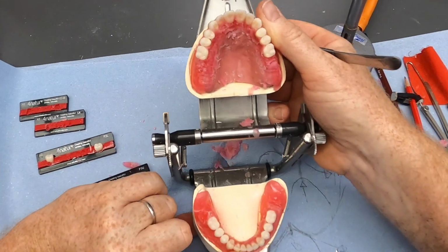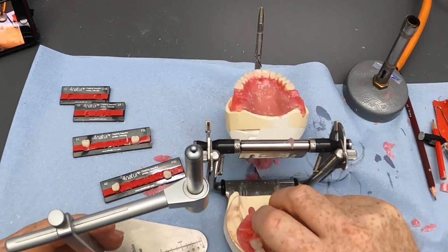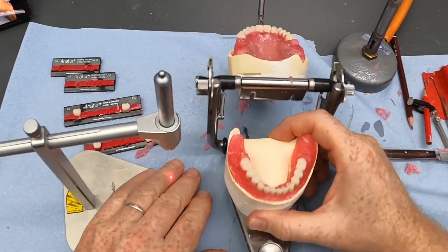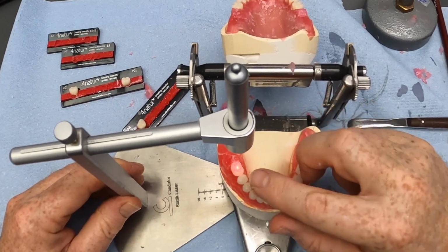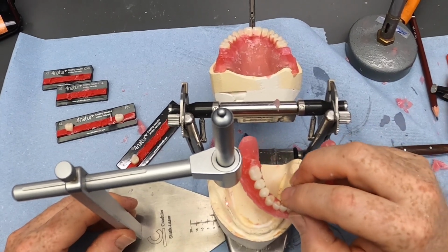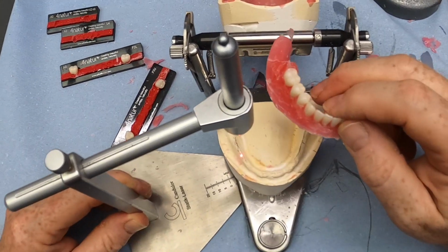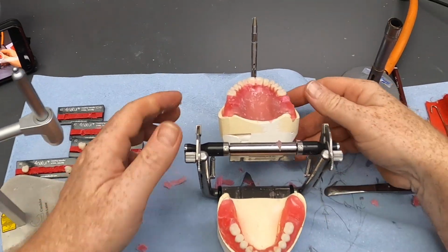Okay, but we're getting there now. Lower teeth look nicely over the ridge. You may have seen me just check that in the setup of the patient's right hand side. I know it was in fast forward, but, stop him, articulator sitting down. So you can see with this fancy gadget we can put the red light over the central fossa of the tooth, and there we go, we're pretty much over the centre of the ridge there, and we can do that for any one of these teeth and see where the alignment is and make sure that we're making the denture as stable as possible.